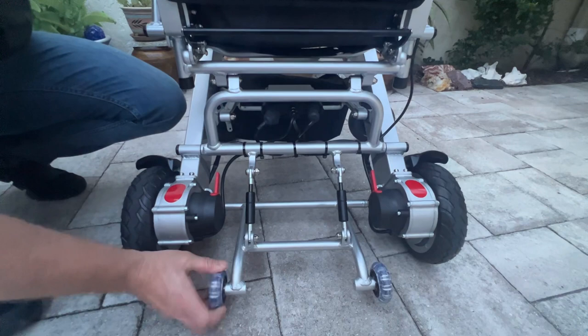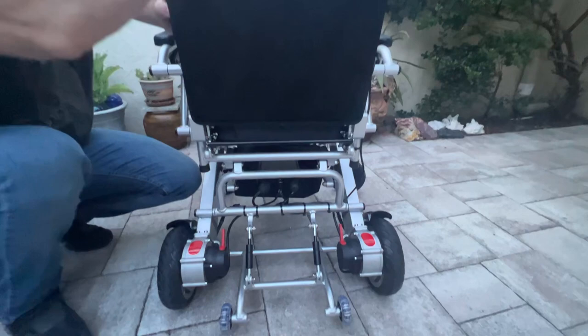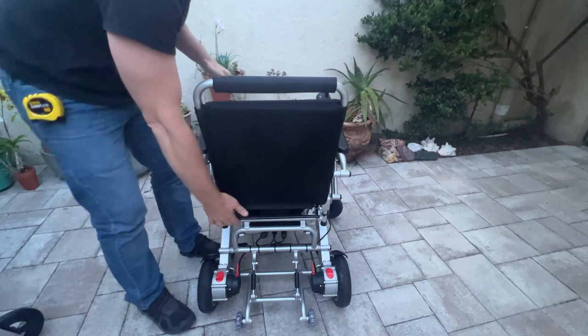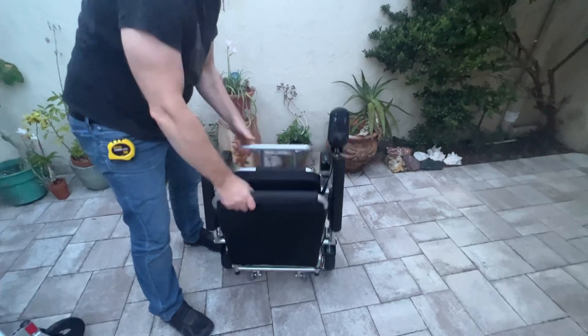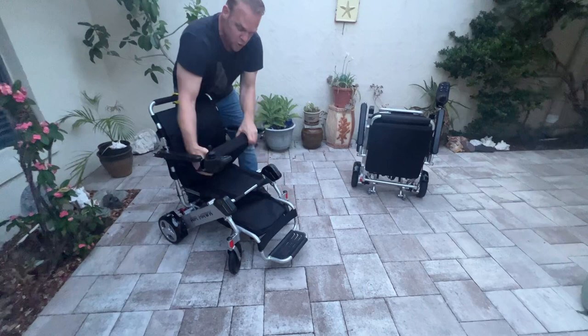The Phoenix also has the anti-tip kickstand wheel assembly. To move the Phoenix into power chair mode, I just lock it and then turn the joystick on. To fold the Phoenix, it's a little different — there's a very easy-to-grab bar. I just grab it anywhere I want, disengage the lock, and fold the chair. Now that I've got the Phoenix folded, let's fold the Air Hawk up while it's fresh in your mind.